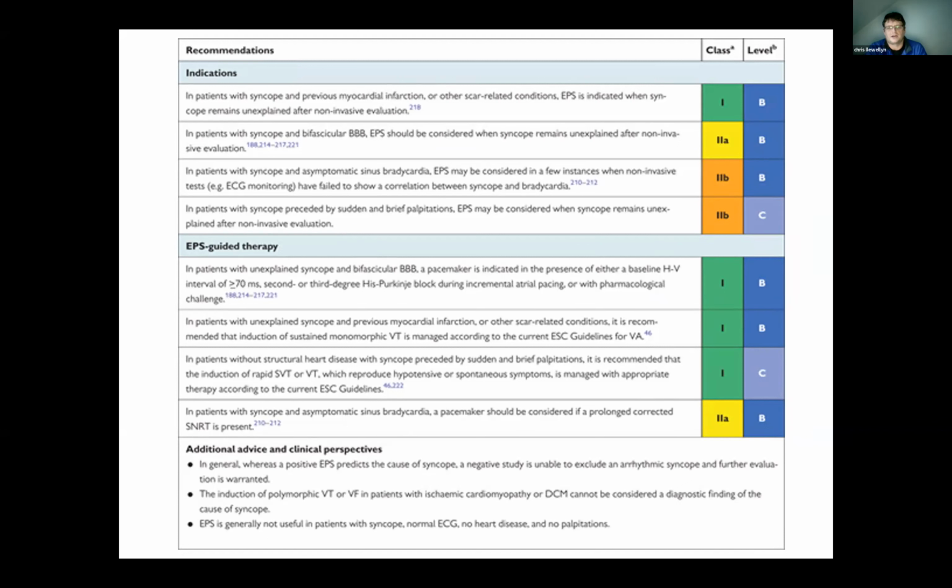The risks of tilt table testing are extremely low. It's performed in a hospital environment. We are in a ward area, part of the cardiology ward, so we have access to a full cardiac resus team. You don't really ever need it. You tip a patient back, you get them back. That's the bottom line. The relative risks are extremely small, in the 1 in 15 to 20,000 sort of territory for serious risk, and most of the serious risks don't involve death. So there's a small risk of MI or stroke with any of these tests, but I think the relative risks are absolutely tiny. The problem is it's anecdotal evidence. You just get one bad story that you remember, and then everyone panics about it.